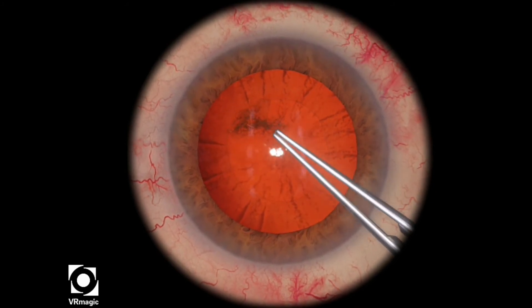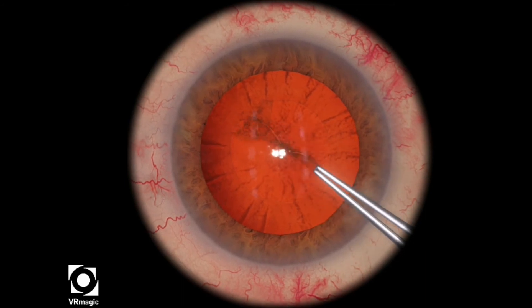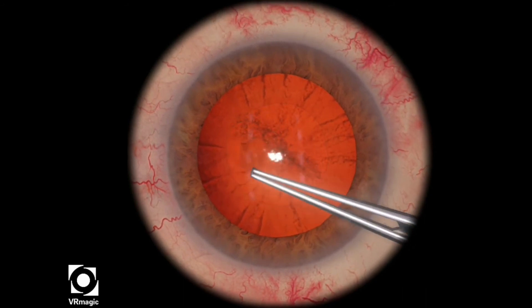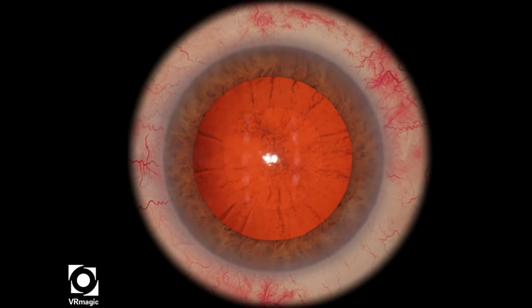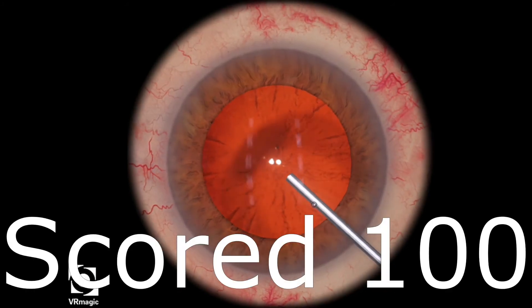So I tend to go slow and I use a shearing technique more often, and you just want to try to go there — and that's actually a really nice circle. I'm surprised at myself.